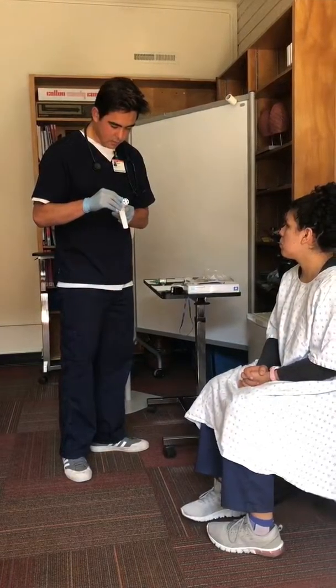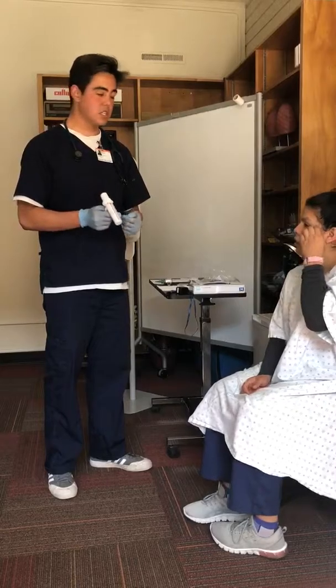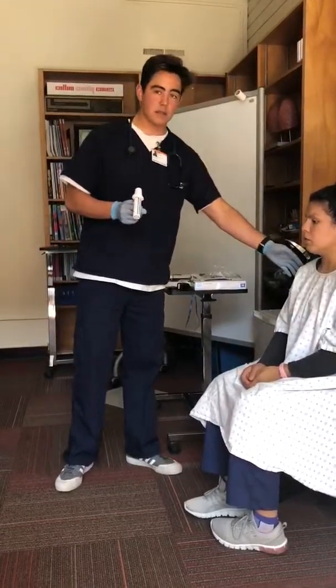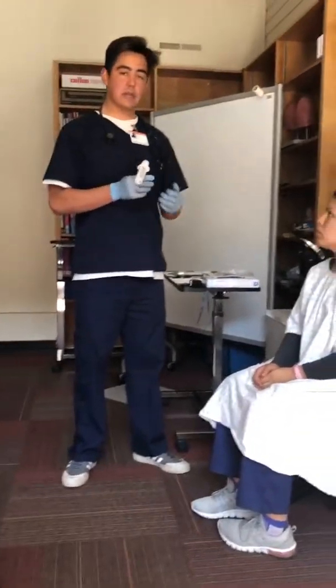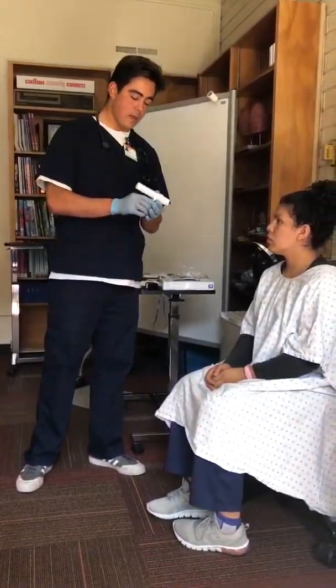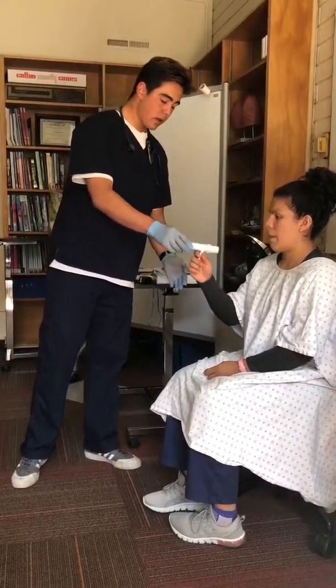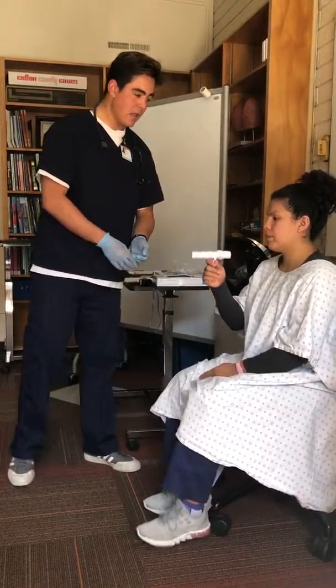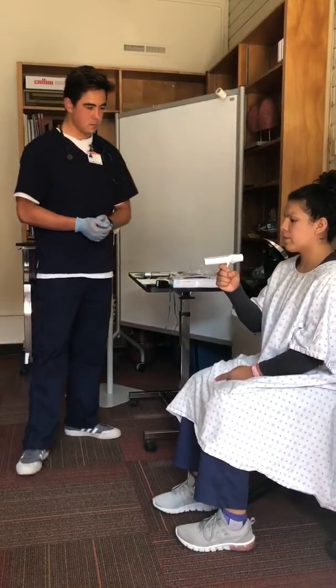Okay, thank you very much. So at this point, we're going to place our patient into Fowler's position. Upright works. We want the patient to be upright, head up, shoulders back with good posture. This is going to do for Fowler's position since the patient's able to hold themselves upright. Go ahead and hold that, feet planted firmly on the ground. And we're going to take the best of 3, okay?